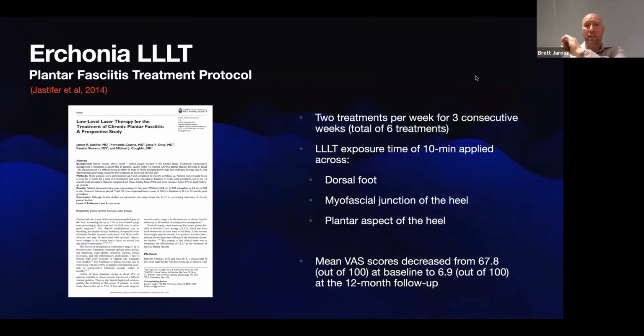Maybe I change gears a little bit here and I start to add movements into the actual therapy. Maybe I start to do things called swimming upstream or swimming downstream, where we might start to treat local areas, then we might start treating nerve roots, cerebellum, parietal cortex, frontal lobes, the mapping aspects of that body part, and combine it with movements, combine it with vibration stimulation. We're going to go into these in webinar 3.